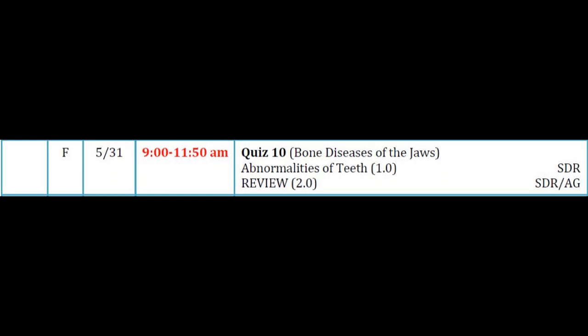We have a retained primary, and here's a cuspid. I know you're not used to working with mixed dentition. This is cuspid. Permanent lateral, permanent lateral, permanent central, permanent central, permanent lateral. How many permanent incisors are there? 5. So we do have a supernumerary tooth. So you got to count teeth, and you have to know how many there should be. So there are 6 incisors. 1 is a retained primary, which doesn't count, but there are 5 permanent. So that patient has a supernumerary lateral incisor.